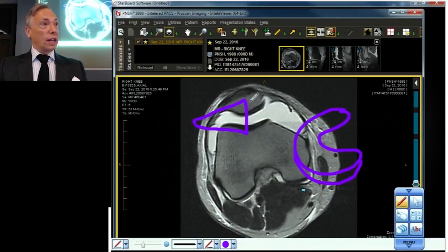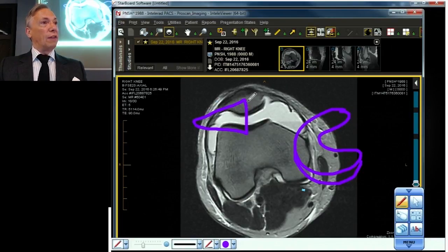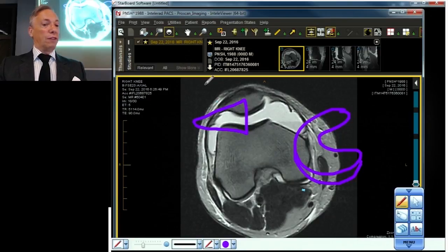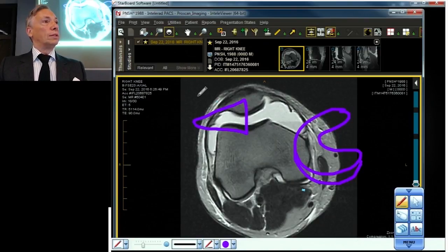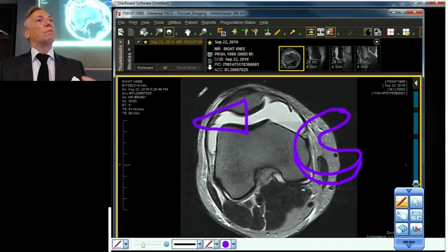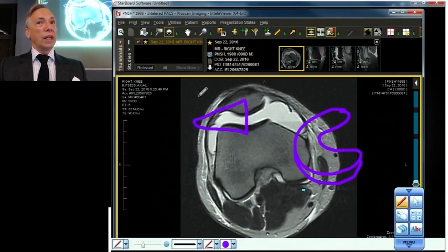Occasionally, if it's really violent, this will break off its attachments and flip over on itself — it will tumble. That's a true meniscocapsular separation. Those are really uncommon — in fact, they're rare.